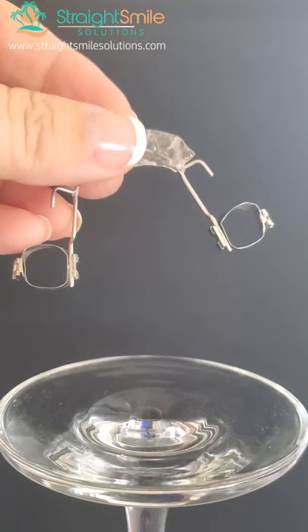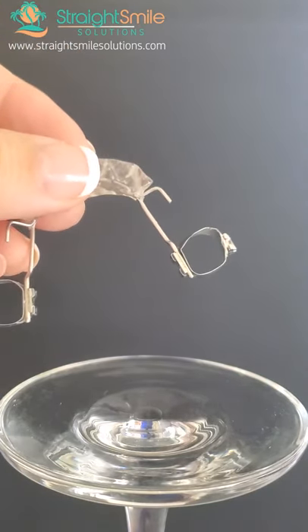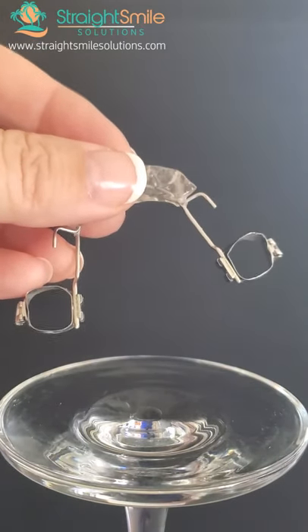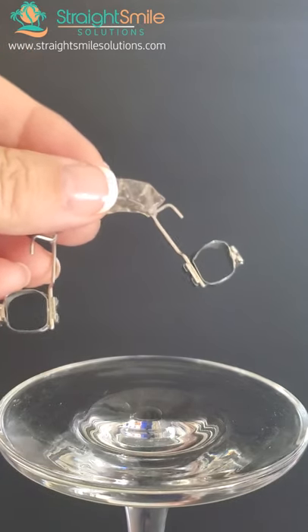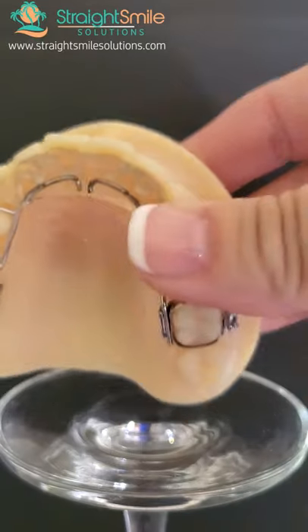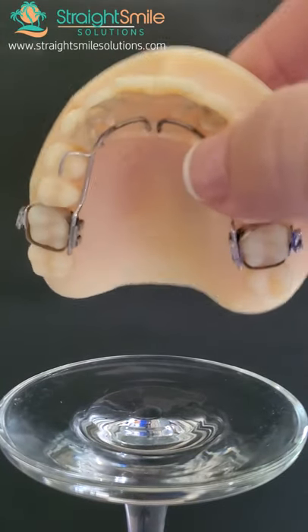You just literally try it in first. Make sure it fits. If it fits good, take it off. Having a band remover is helpful to take it off, but you don't have to have that — you can do it with cotton rolls and fingers too, depending on the fit. Then cement it right on like this, and light cure it. That's pretty much it — let it cook.